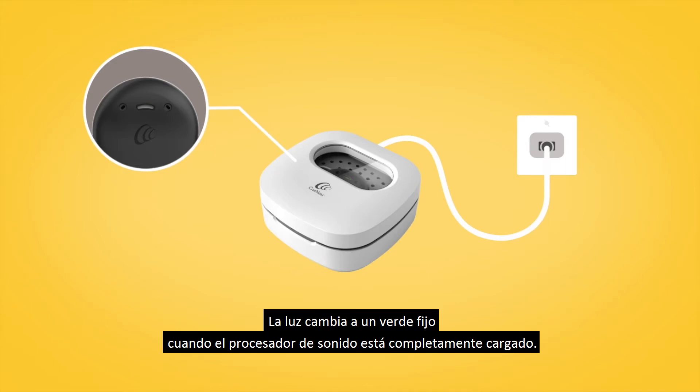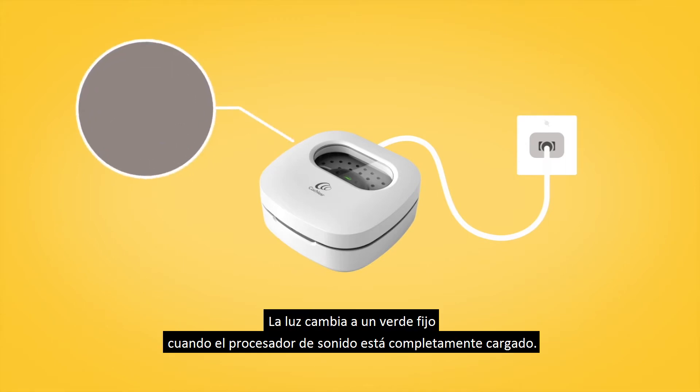The light changes to a steady green when the sound processor is fully charged.